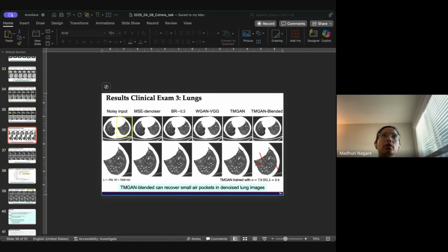The choice of frequencies we deal with and the noise power spectrum is mostly from what clinical experts like. They are interested in those frequencies. They are familiar with the very traditional images, which are obtained with filter back projection, and filter back projection has that kind of noise power spectrum. So we use that as a reference. That is from the clinical point of view. We didn't explore other noise power spectra yet, but that is a good direction to check.